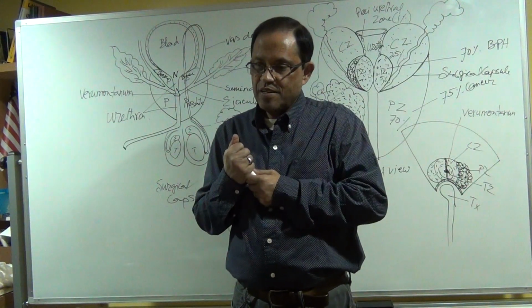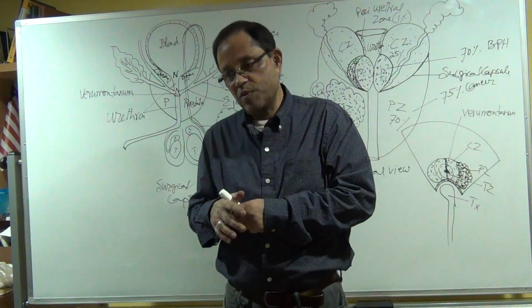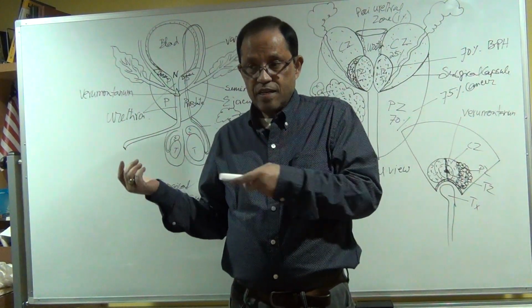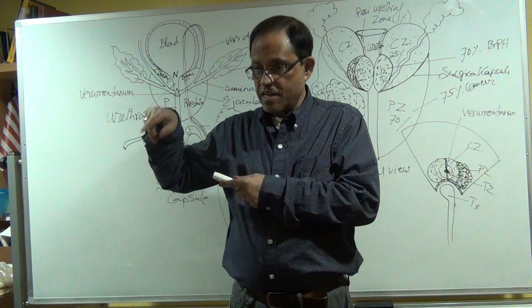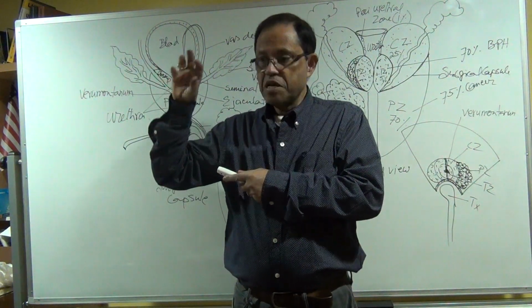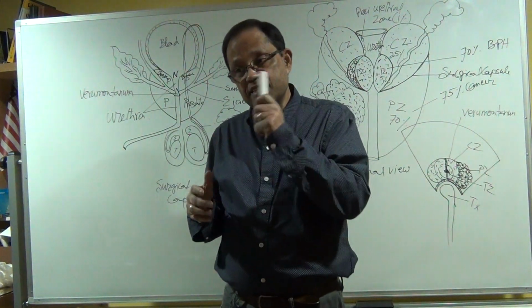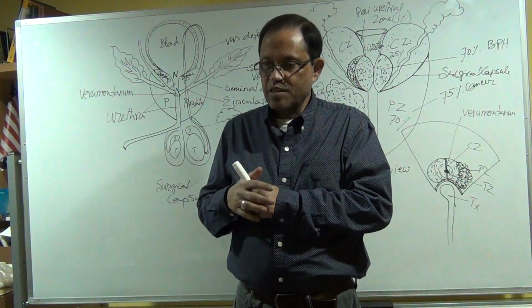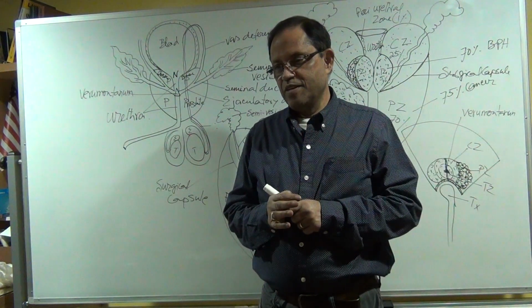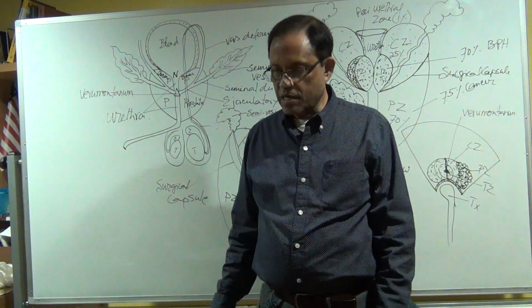Okay, so ultrasound use is everywhere, and with color Doppler you can see if it is malignant, then hypervascular at that area. At that area you will see it is heterogeneous, hypoechoic, irregular border, hypervascularity, calcifications, necrosis. So you can check all of it by ultrasonography. Okay, so that's all for the prostate gland.